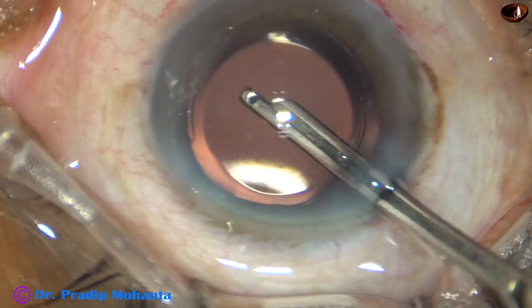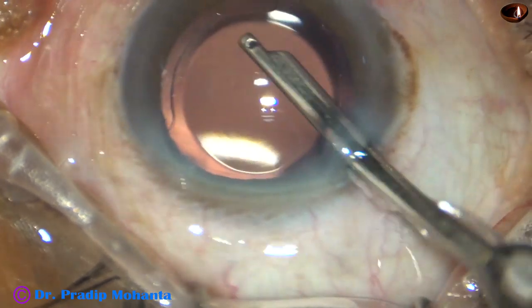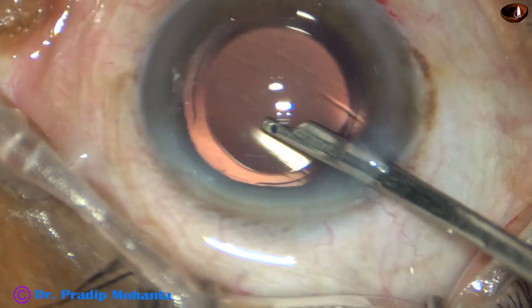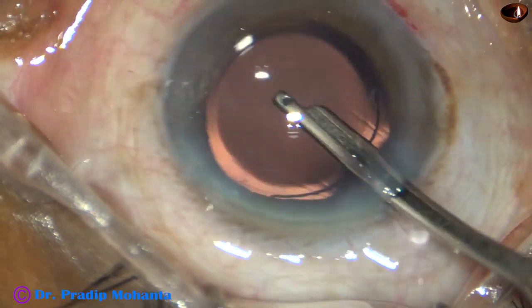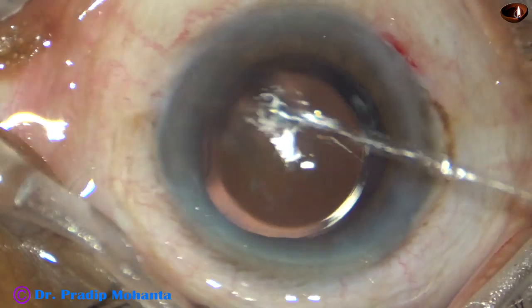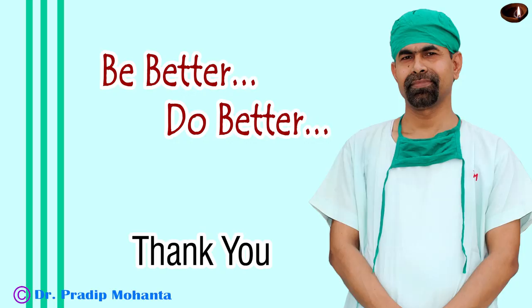The posterior capsule protector is a very good instrument, particularly in cases where there is zonular weakness and there is trampolining of the posterior capsule — particularly in hypermature morgagnian cataracts — and whenever there is a little bit of surge. Thank you very much for your attention. Hope this video will help you in developing your surgical skills. Be a great surgeon and serve your patients with love, respect, empathy, and great surgical competence.